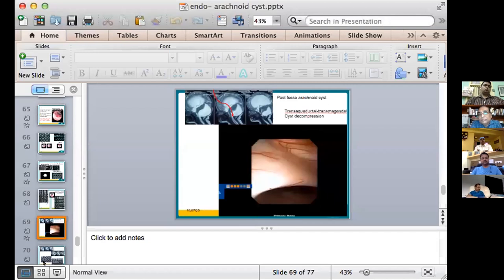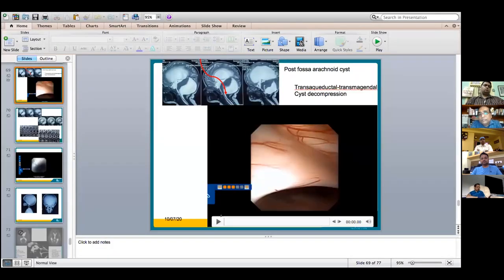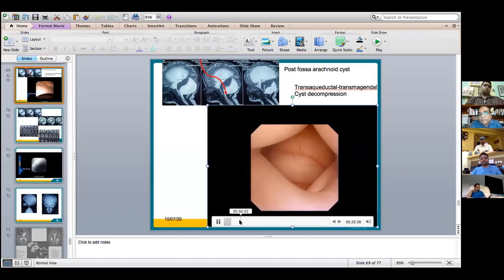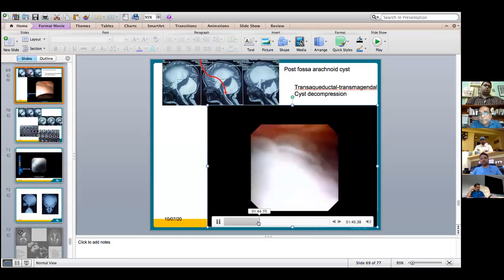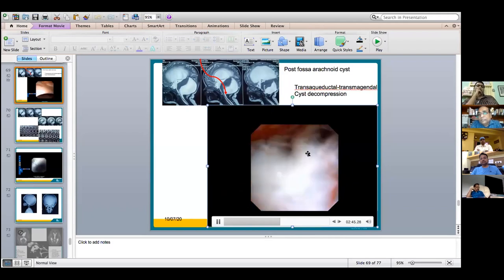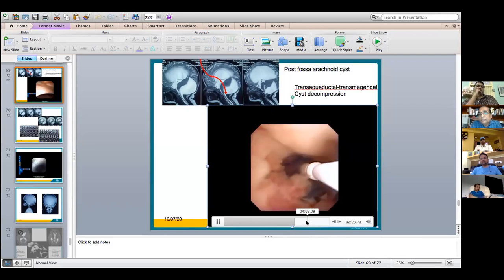One minute, I'll just take it into the presentation mode. And forward it. So once you're into the foramen of Magendie, you can pass the flexible scope and you can see the cyst here, the complete cyst and everything. So this becomes, I mean, as we do more and more, we know that the indications, depending on your comfort level, become more. Slightly, you have to be careful in the initial phases, but it's okay.